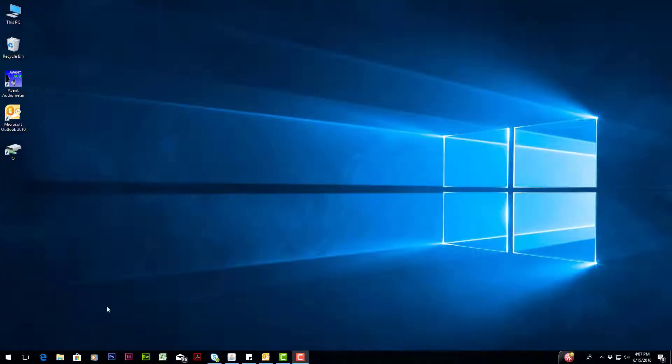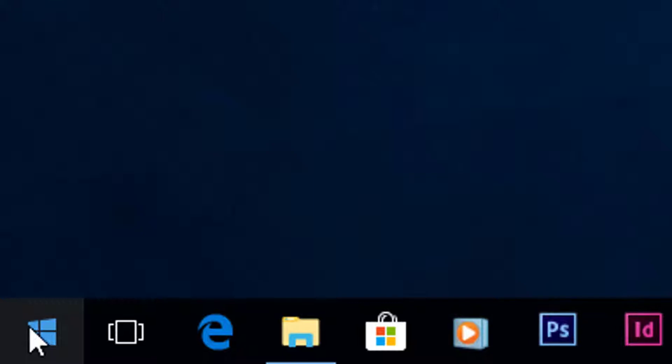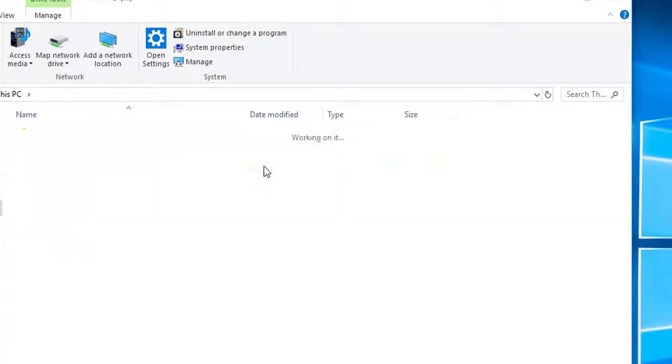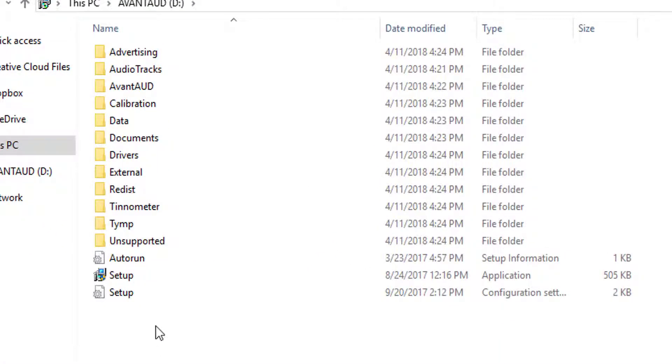On a computer running Windows 10, launch My Computer. Go up to the File Explorer. Locate the USB flash drive on your desktop. Double-click on Setup to launch.